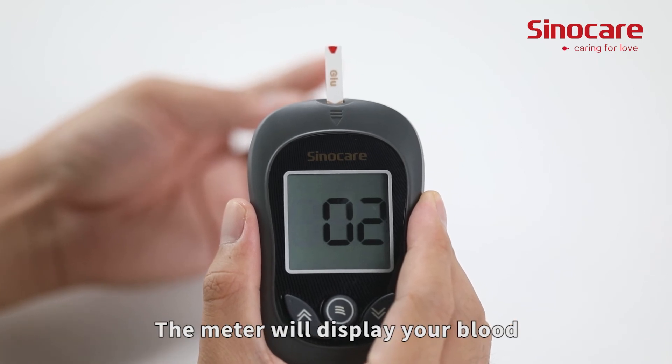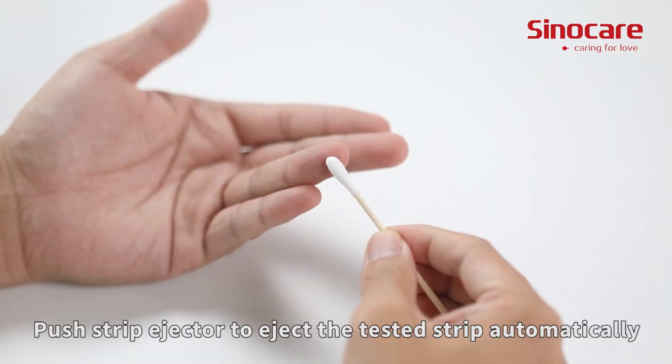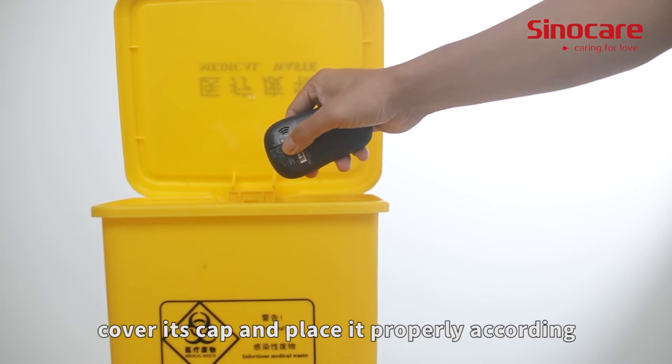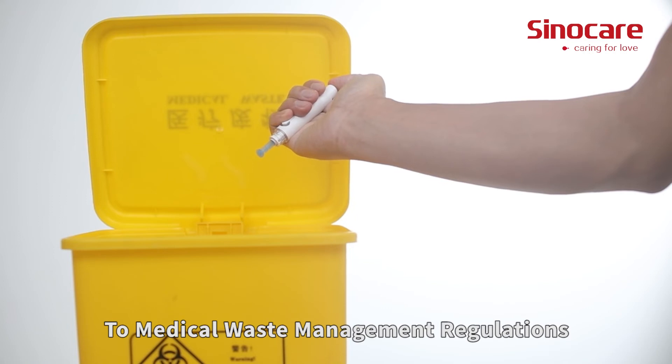The meter will display your blood glucose value after five seconds. Push the strip ejector to eject the tested strip automatically. Twist off the lancet, cover its cap, and place it properly according to medical waste management regulations.